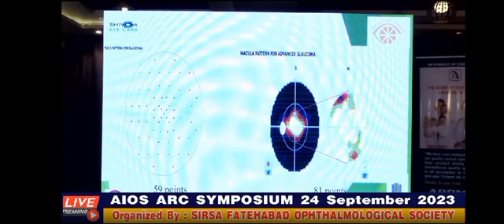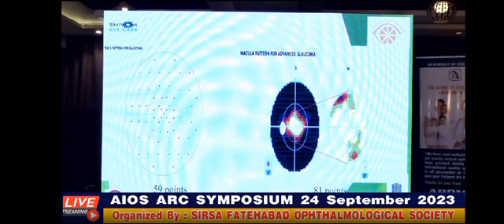So the G pattern is the most commonly used test pattern, and it contains 59 points that are arranged along the retinal nerve fiber layer distribution. The M pattern, on the other hand, has 81 points with a high density of test locations at the fovea, mostly used for macular disease, drug-induced maculopathy, and advanced glaucomas.